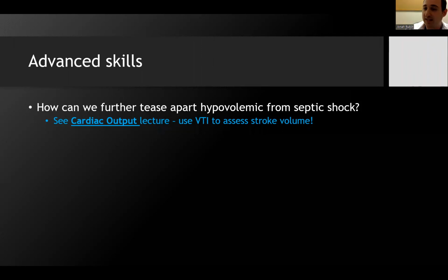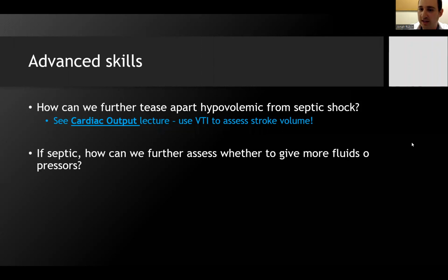A VTI is not a basic skill. We've talked about it in our course because I think it's one of the most important advanced skills. Over time, I think it's going to become an expectation that everyone has the ability to perform. But for now, it's still counted as an advanced skill, though very powerful in guiding a situation like this. If this patient is septic, how can we further assess whether we want to give more fluids or pressors? These are some echo-based skills that can help you guide your management.